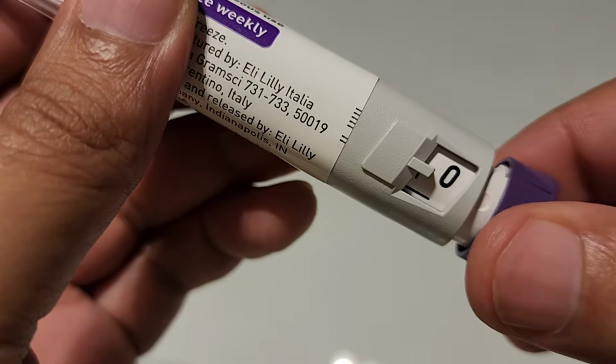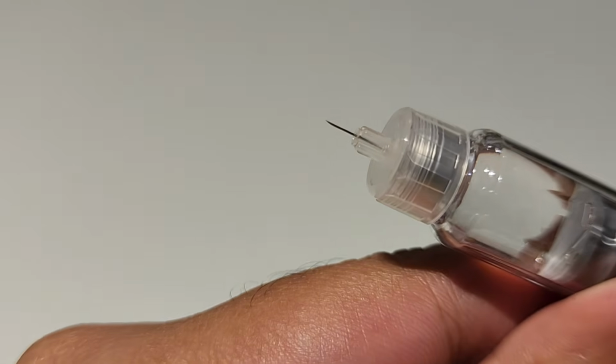Where should you start the click count? You can actually start the click count from point 0 or from the first mark, depending on your dosages. Now remember that the first click after the 0 mark is meant to be used for priming the needle. It means that when you use the first click, it actually delivers only a few drops of medication to fill the lumen of the needle of the pen device, and this is called priming of the needle, to ensure that the pen is working and the needle lumen is filled up. And usually you see a few drops coming out.